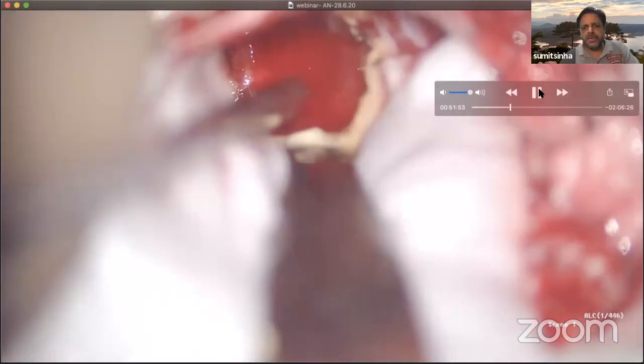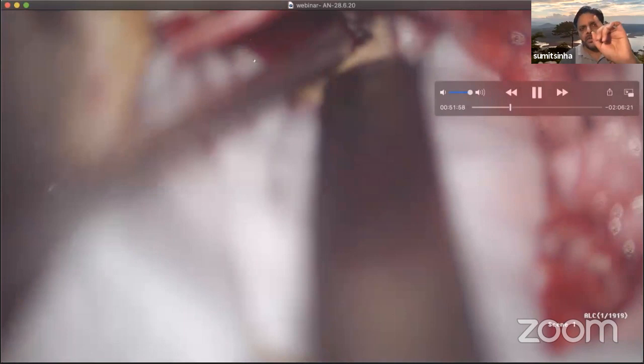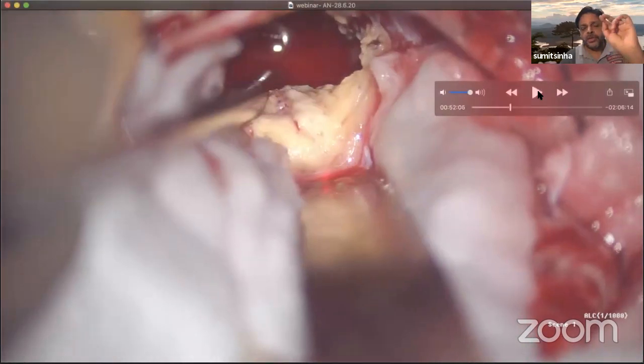My purpose of drilling the meatus is only to find the distal part of the facial nerve. Now, when I come to the facial nerve, it is most likely to be seen at two points during its course. First is the proximal point where it emerges from the brainstem. And the second most constant location of the facial nerve is in the fundus of the meatus. Mind it, not the porus, the fundus of the meatus.